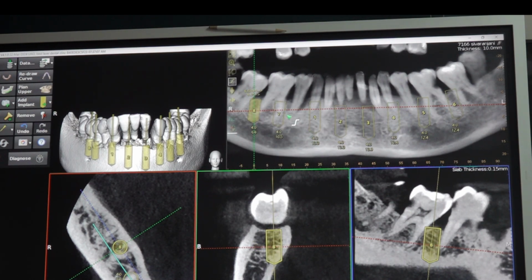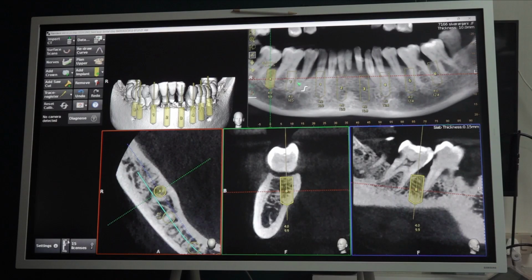Actually, we need only 6, but these two are some additional to prevent any cantilever, to allow for distribution, okay. To withstand if the patient is chewing very heavy food. Right? Out of enthusiasm, they may try everything. So it is a cushion factor against any implant failure or any complication. Placing it.